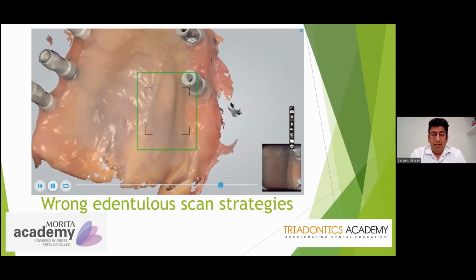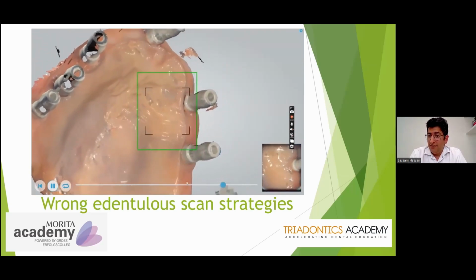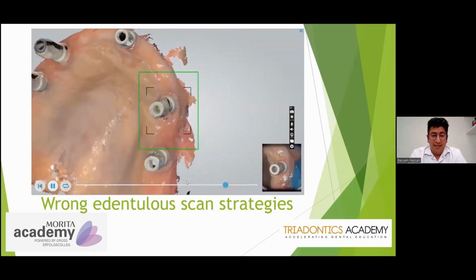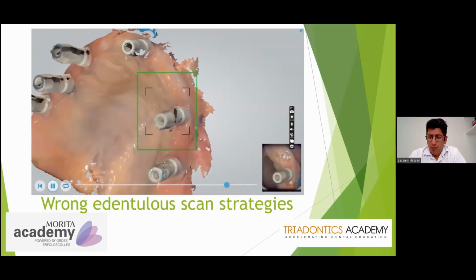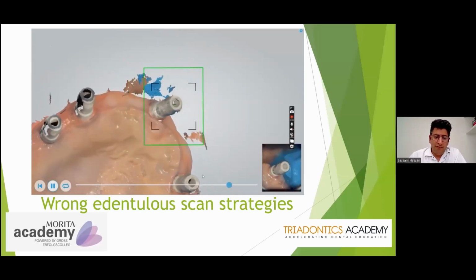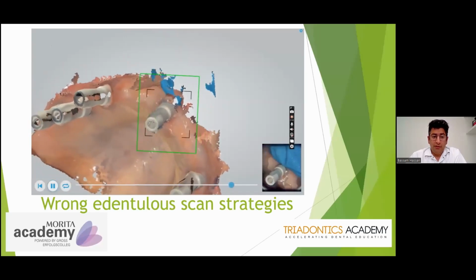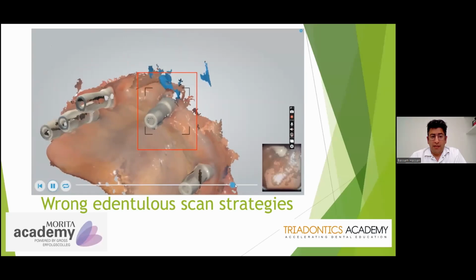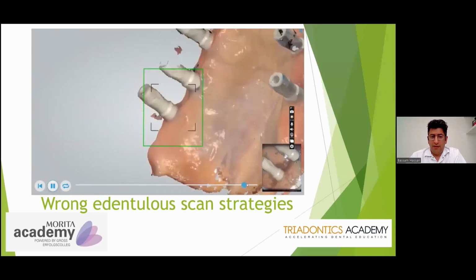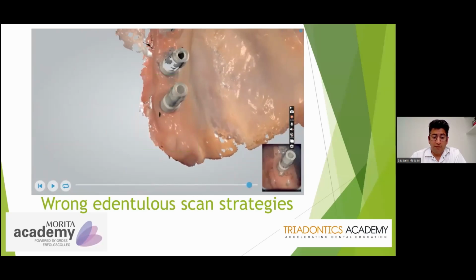The danger with this is that he didn't even see the mistakes he made with the scan, and he just sent it, relying heavily on the post-processing of the scanner. Luckily, I saw it when the designer noticed that the scan was wrong. So even though we have progressed in the last 15 years with intraoral scanning quite a bit, you still need to know sound scanning principles. You still need to know what the scanner is doing, what the stitching strategy is, and how to scan for full arches.